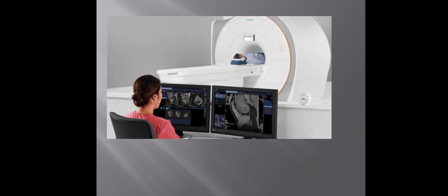However, it may be perceived as less comfortable by patients due to the usually longer and louder measurements with the subject in a long and confining tube. Additionally, implants and other non-removable metal in the body can pose a risk and may exclude some patients from undergoing an MRI examination safely. MRI was originally called nuclear magnetic resonance imaging, but nuclear was dropped to avoid negative associations.